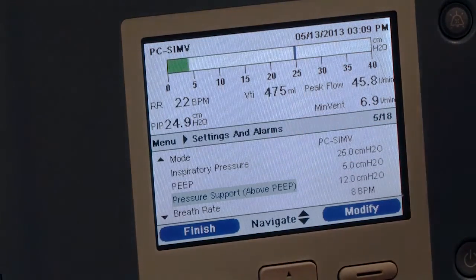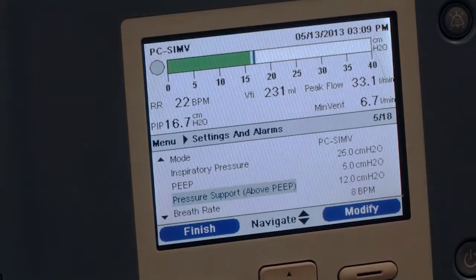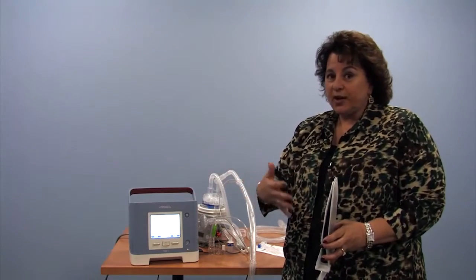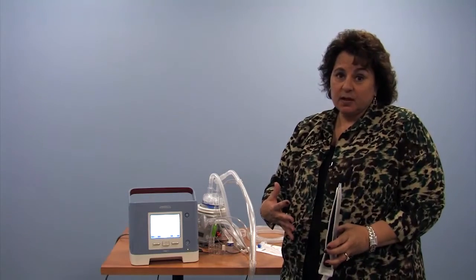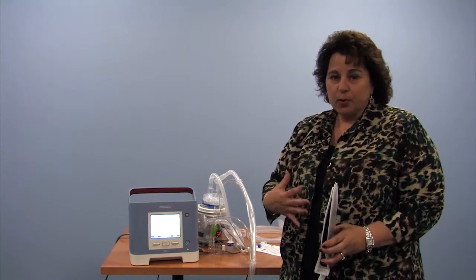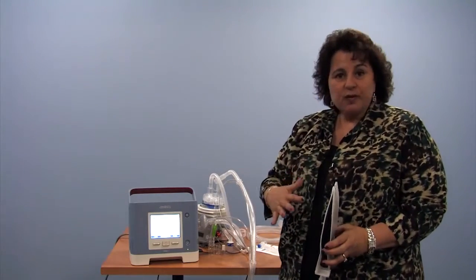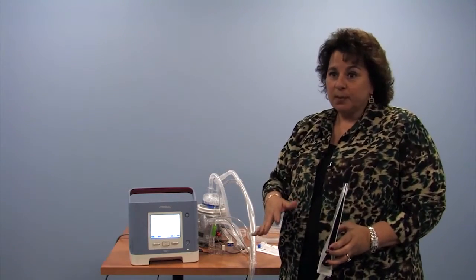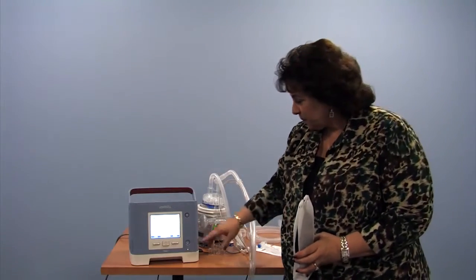And that's something that gets confusing to caregivers in the home at times. Why do I see 2 different numbers? And why, when the child goes to sleep, do I only see the 400s? And do I only see 8 breaths a minute? Well, perhaps when the child goes to sleep, they're not initiating those pressure support breaths in between the 8 mandatory breaths. So certainly if you have any questions at any point in time with your child on life support in the home, please do contact your physician and ask questions about what you see.